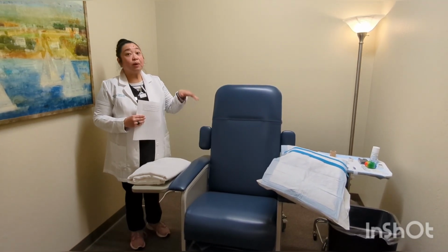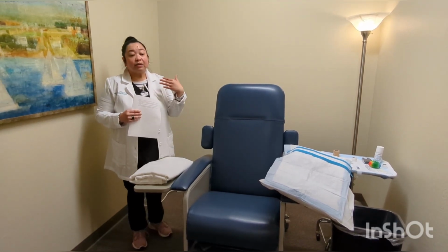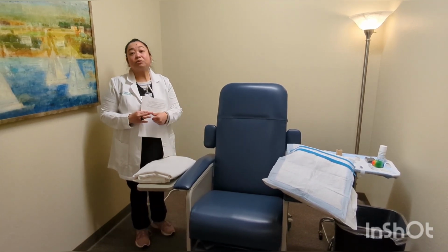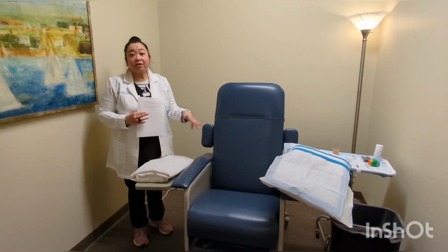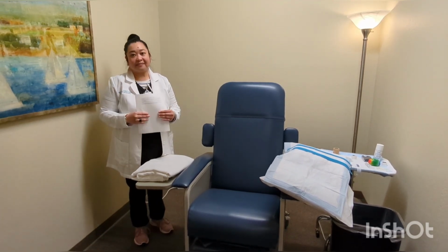In a dim lit room, I usually turn off this main light and leave the lamp on, and they rest here for 10 minutes with their eyes open. After 10 minutes, I come in, give them the same dosage of tracer as I gave them for the concentration scan, remove the IV, give them another 10 minutes to rest, and then after that, we start with the scan.